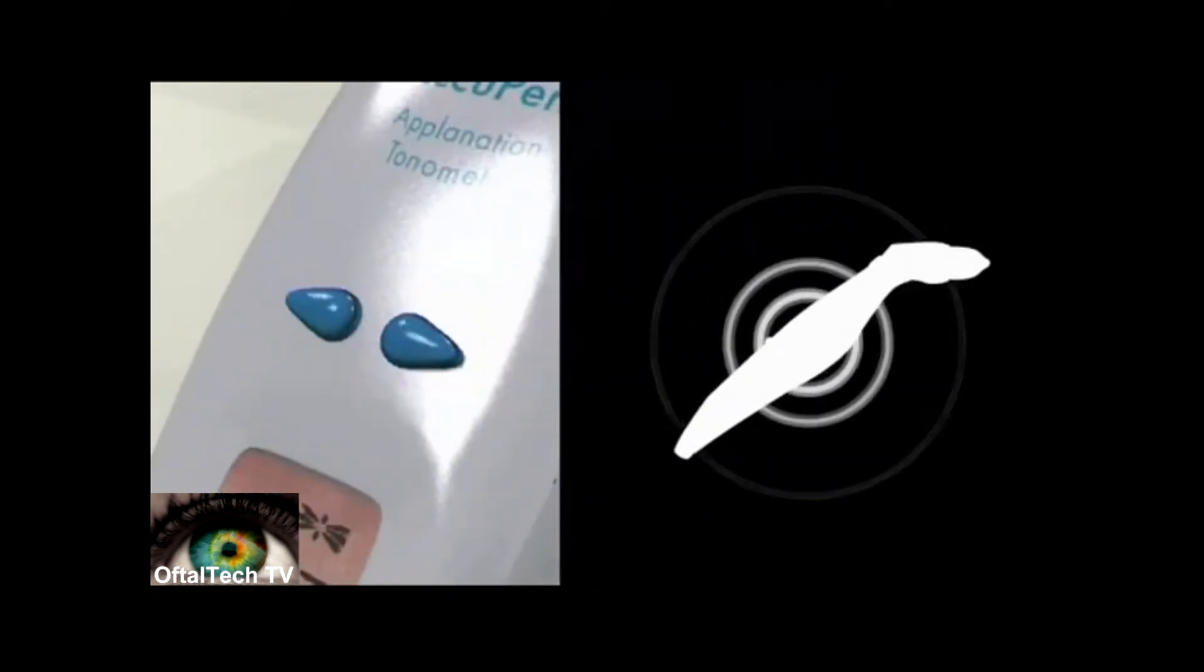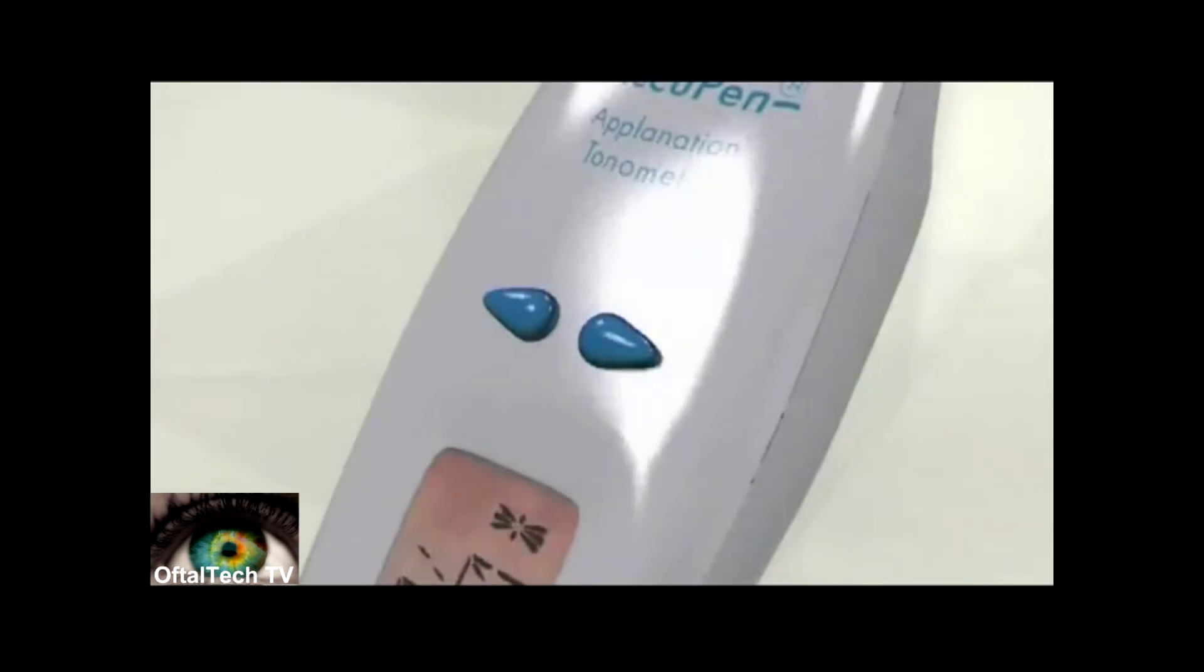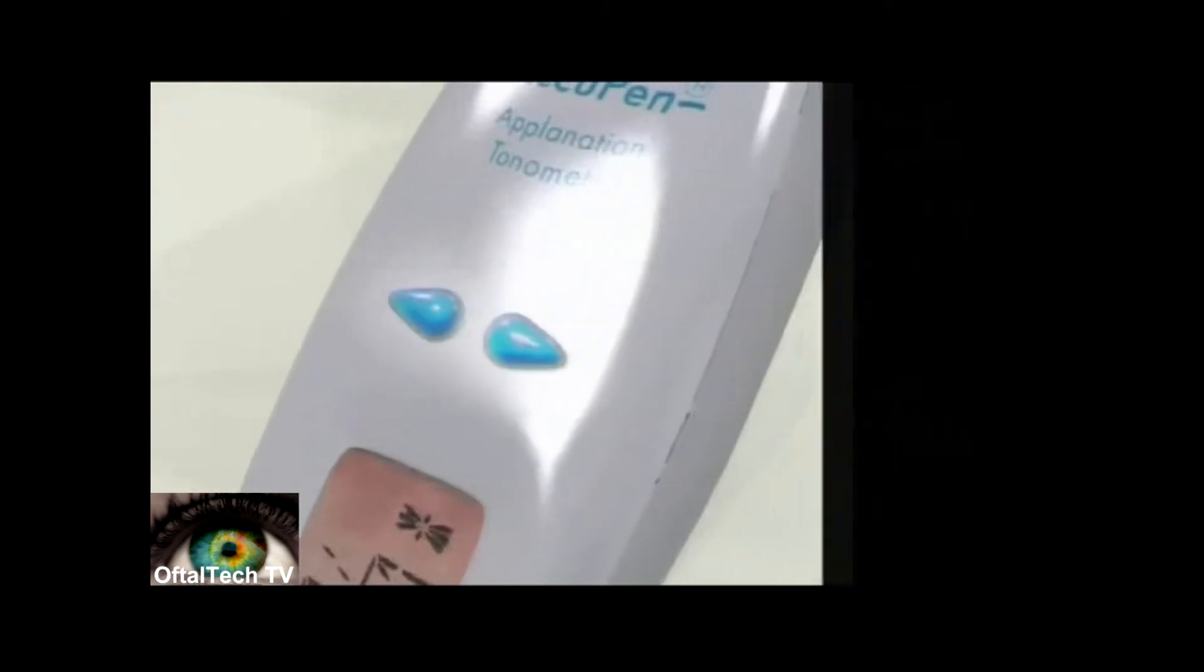After deleting one measurement, the AccuPen will automatically update the average IOP. To clear the AccuPen completely, hold down both arrow buttons for approximately three seconds. The unit will chirp indicating the measurements have been deleted.